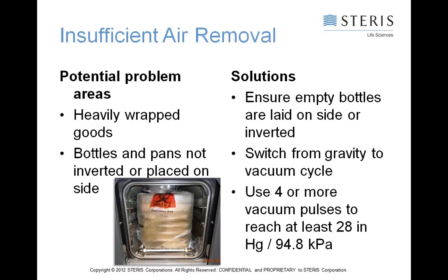Insufficient air removal. This would be not just areas that are going to prohibit steam from contacting the load, but areas that are going to trap the air in. Case in point being that the decom bag I showed would have done both. Prohibited steam from contacting it as well as not allowing air out. But anything that's very heavily wrapped goods, bottles or pans that are not inverted or placed on their side.